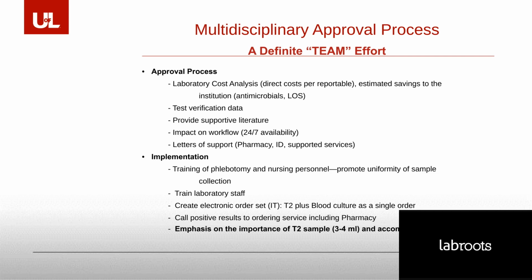So in our approval process, beginning with verification, et cetera, we did our cost analysis, including our direct costs, were reportable. We estimated the savings to the institution based upon antimicrobials and length of stay, and had the cost of 1 day in the intensive care unit and the others, and we used those as our financial foundation to justify our costs.